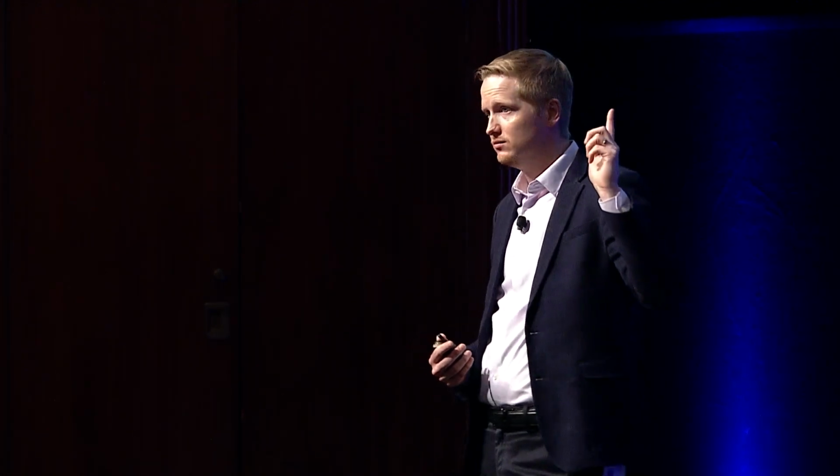What we started doing at Bell Labs a couple of years ago is looking at a technique called Optical Coherence Tomography. This is a 3D imaging technique. You basically take a laser, scan it over something you're interested in, and build up a full 3D image of that thing. It's like LiDAR, but you're pointing it inside the body instead of outside. And so you get these amazing images. This is in a human eye. This is a live patient.